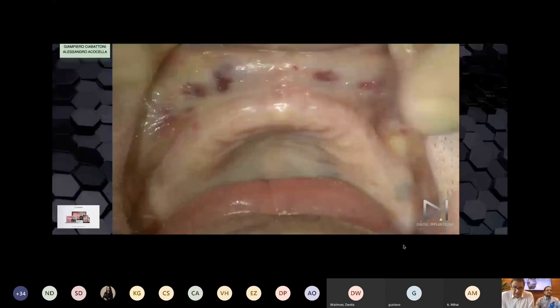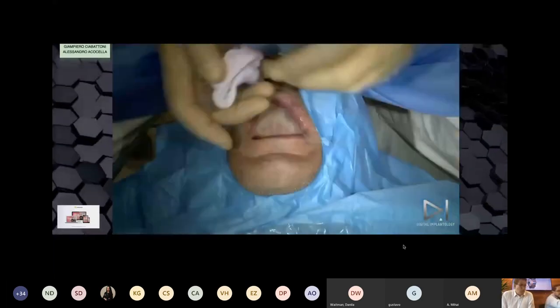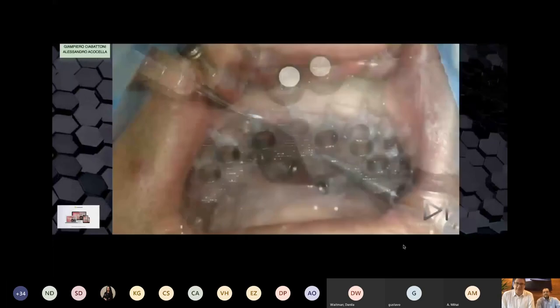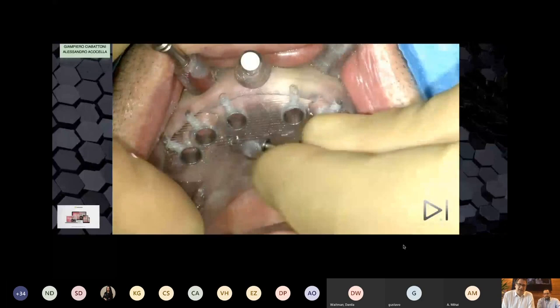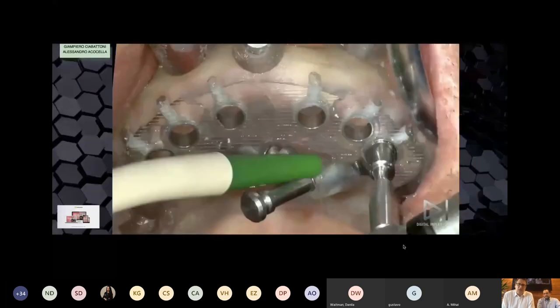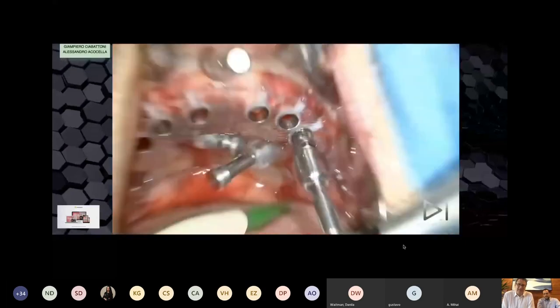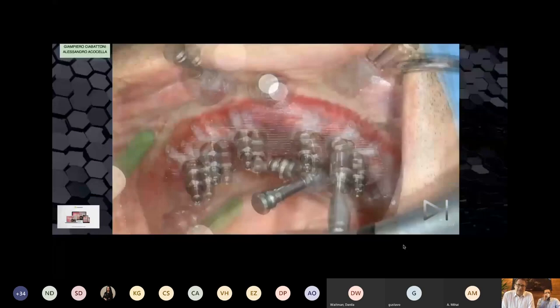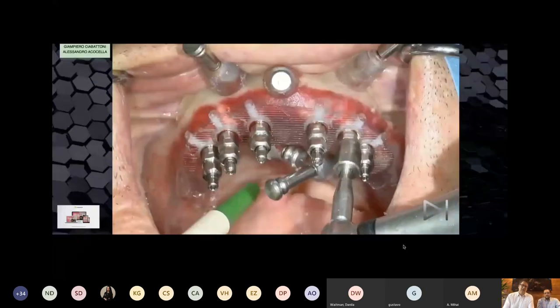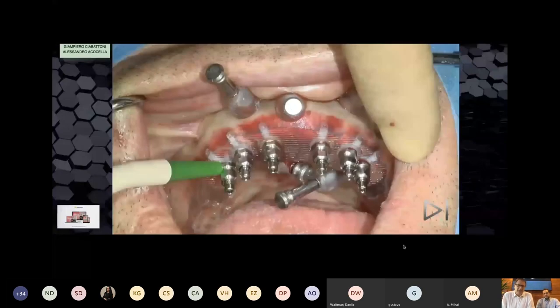We did that surgery during the Congress in Bologna last June. More than 500 dentists, so us. Okay, same stabilization, 2 pins, like we saw in this webinar. Tissue punch, we start to insert the implant. First implant, look at my hand, without any touch. Drill, implant, and now the last accommodation of the implant. The last adjustment.